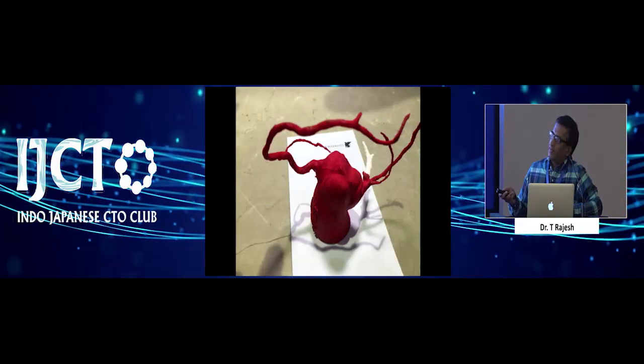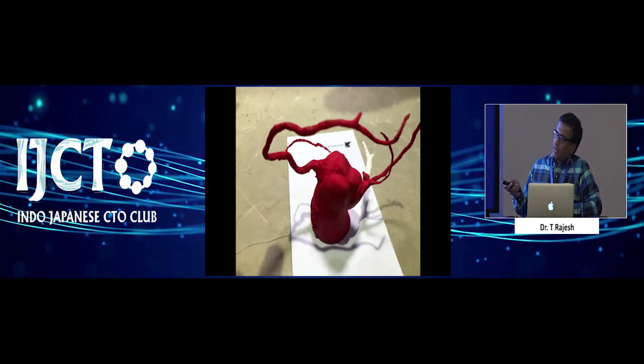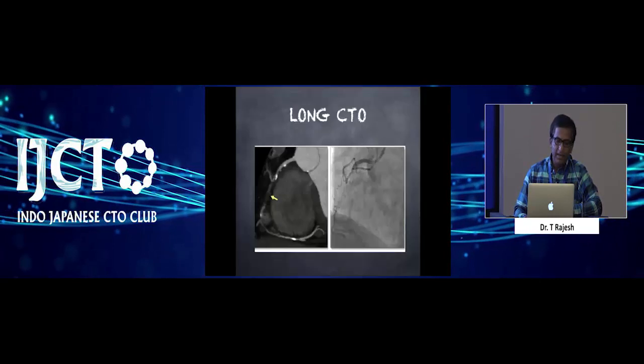And the same thing is seen in a conventional caudal projection. We can see the LAD here, and we can have an idea of the trajectory of the vessel as well as the caliber of the vessel when you want to plan intervention.